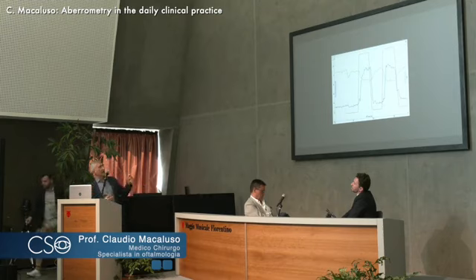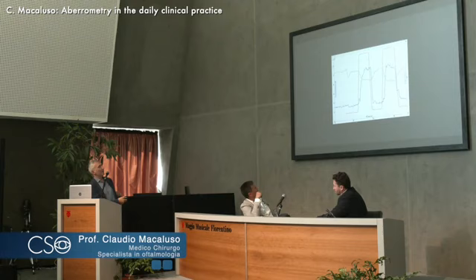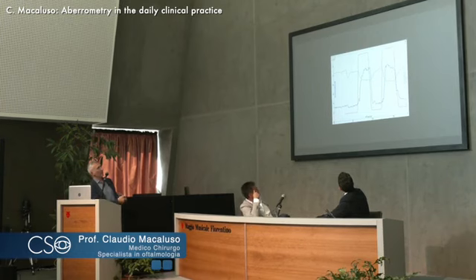In this case, the red line is the change in diopters of the target. So this goes near by 8 diopters. And this is the spherical adaptation in real time. You see how many points we have. We can even check how fast the accommodation is. And this accommodation goes down, up.